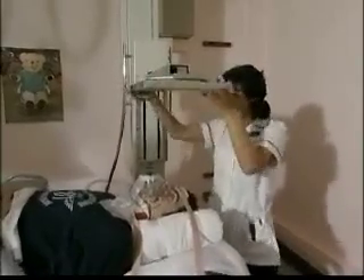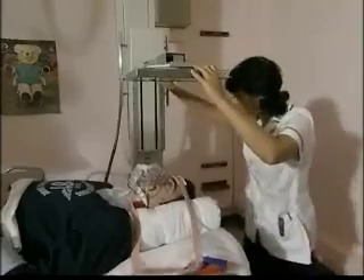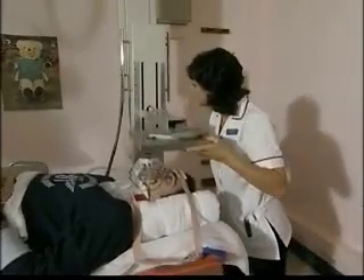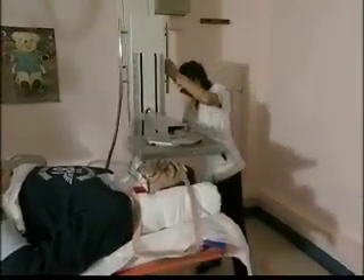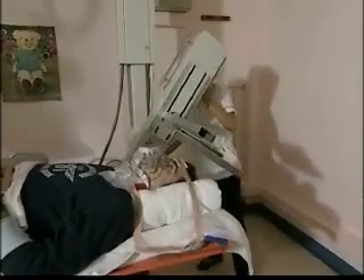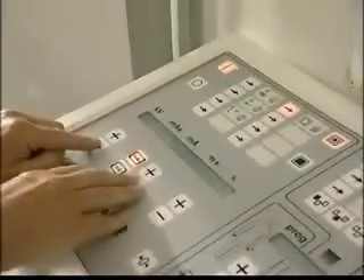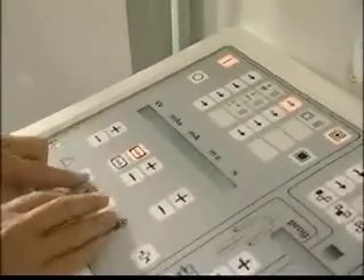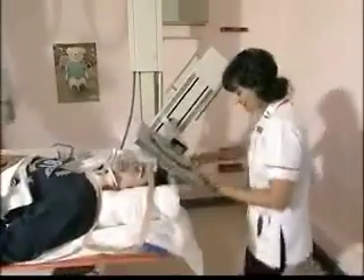This will come down in front of your face but it's not going to hurt you. You hold very, very steady there for me. That's our first picture ready to take. Having checked the alignment, the radiographer withdraws behind a lead glass screen, selects the exposure, and proceeds with the X-ray. OK Alan, nice and steady for me please. OK Alan, well done.